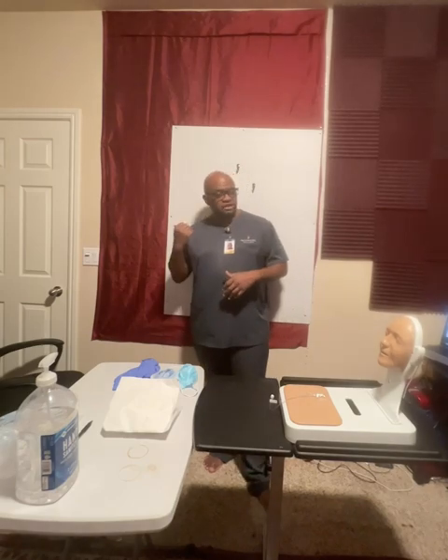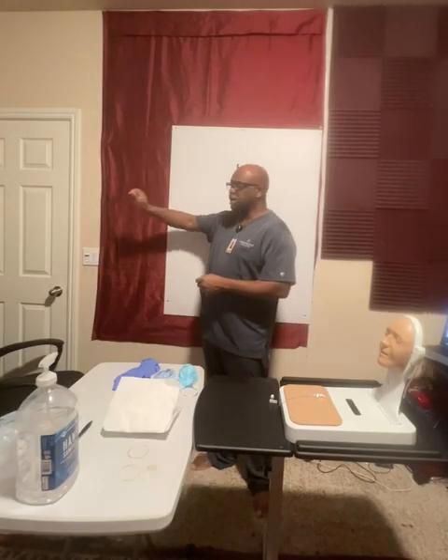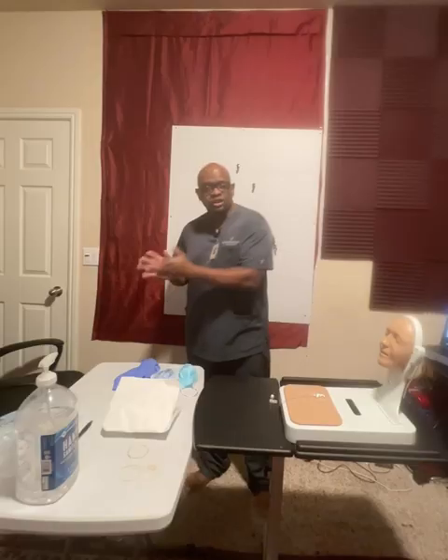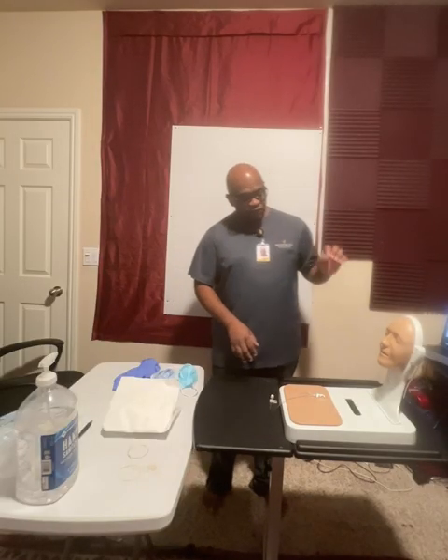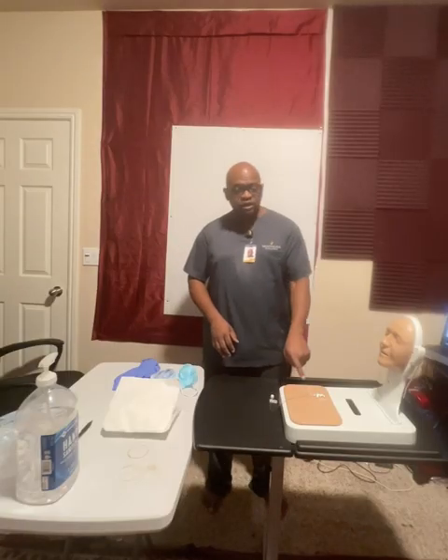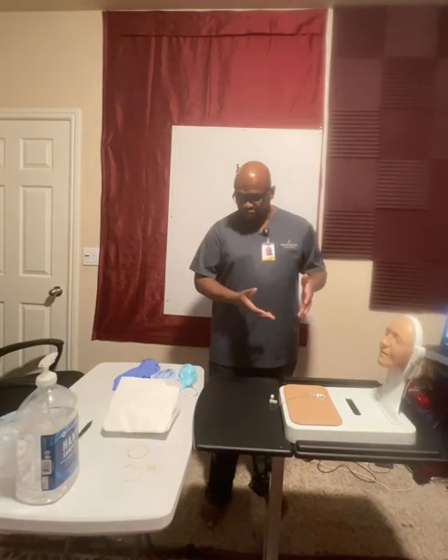So I already checked the doctor's orders. I came into the room. I introduced myself to Mr. Jones. I explained to Mr. Jones why I'm here. I went over and I provided privacy. I did my hand hygiene. I washed my hands. I came back. I verified Mr. Jones' ID with 2 sets of ID by having him verbalize and confirming the information that's on his ID band. That was good. As I said, I already explained to Mr. Jones what's happening. So I'll go ahead and get started.